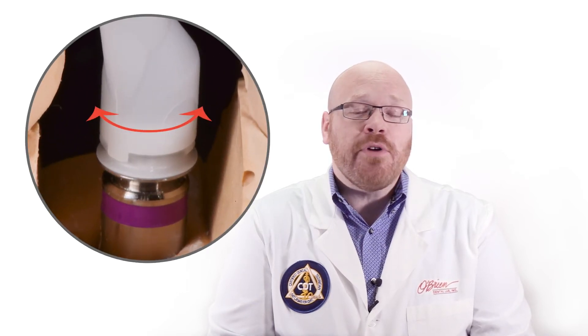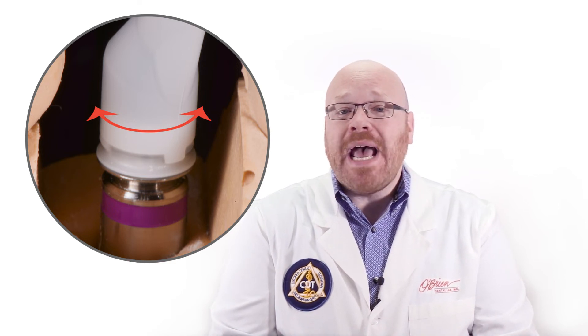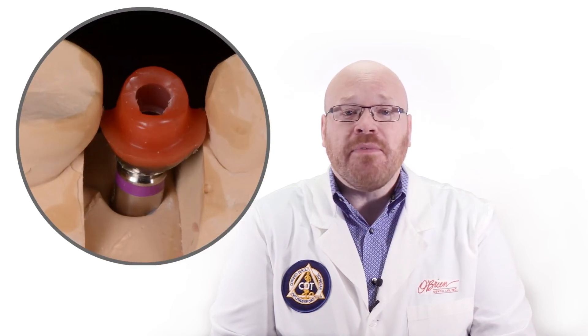The first piece snaps onto the VarioBase abutment, and then the second piece fits on top of the first. This second piece can then be rotated to control the direction of the angle. Once the desired angle direction has been set, the technician adds wax to the two pieces to hold them together and then completes the wax-up of the crown or coping.